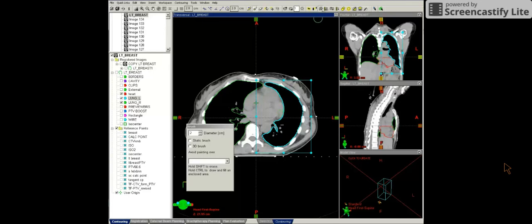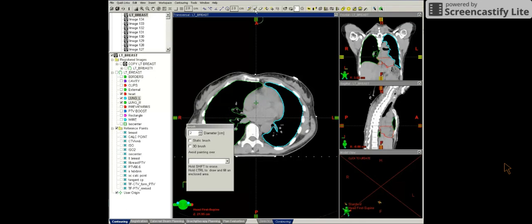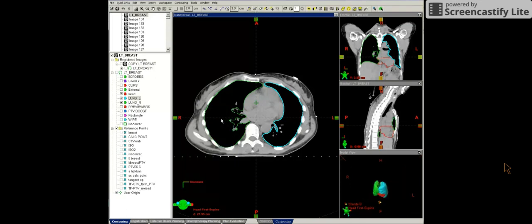So essentially this is how we would contour the left lung. And I've left the right lung here to show you how it should look when it's complete.